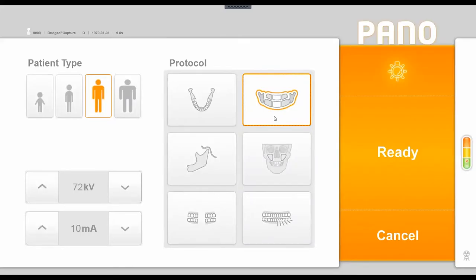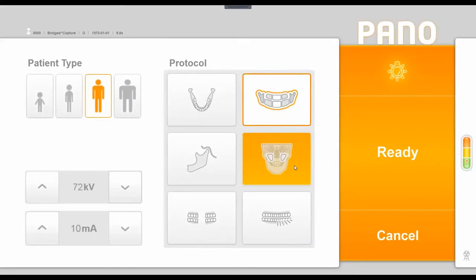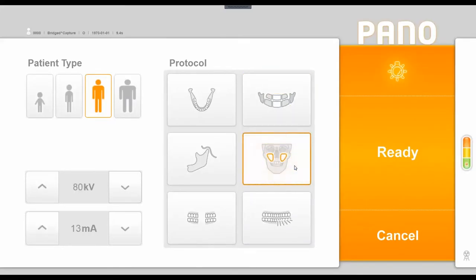Below the segmented pan option, we have the ability to do a two-dimensional sinus shot, which would require a slightly different chin rest within the machine and slightly different positioning for the patient, but it still will do a similar rotation around the patient.